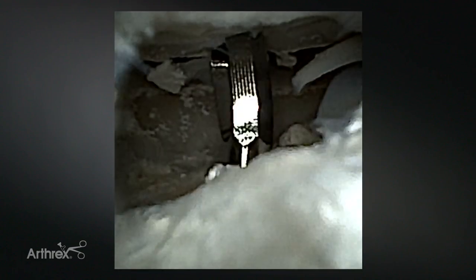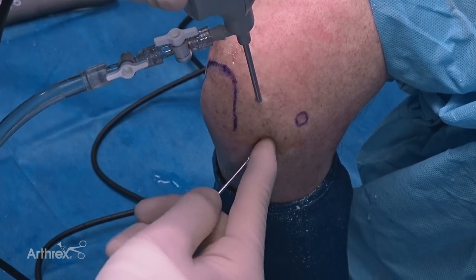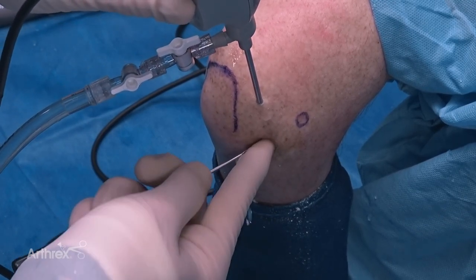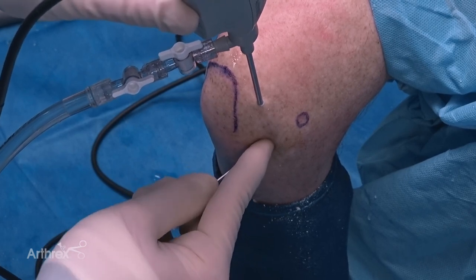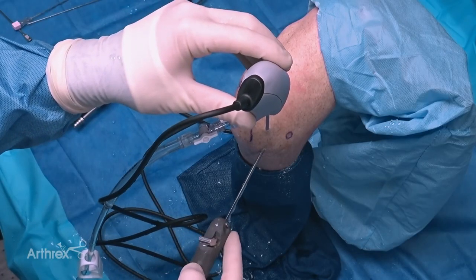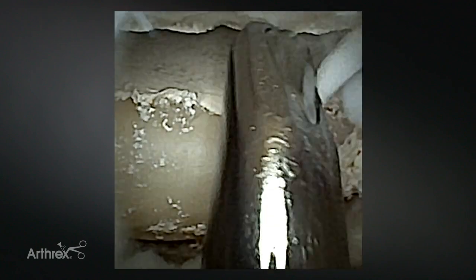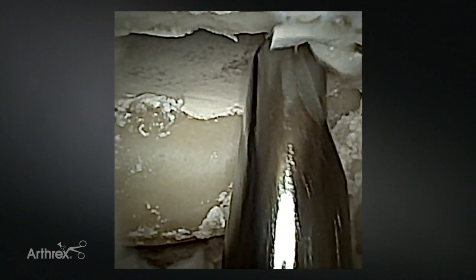One of the things I like about these instruments is their small size, which allows you to get into these tight spaces. They come in seven centimeter and ten centimeter lengths, allowing you to get really close to the elbow. You can see I've got one finger on the skin and I'm still holding the instrument in my hand, which allows me to apply quite a bit of force in a controlled fashion so I'm not doing any unintentional damage. Now that we've used the curette to debride and prepare, we'll use the shaver to remove any final fragments and utilize the graph net to help catch the debris.